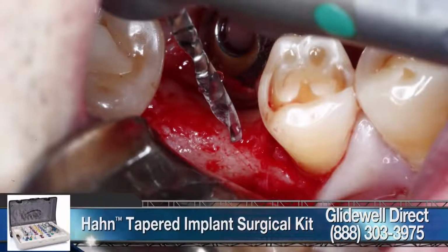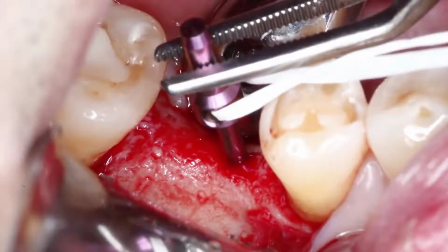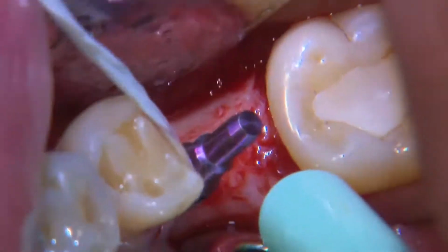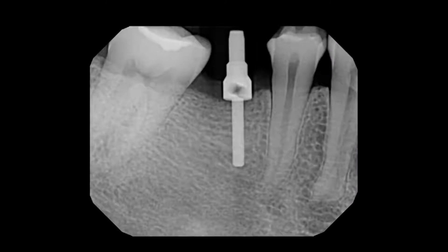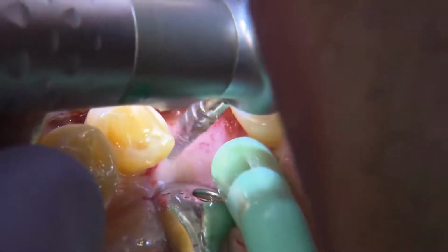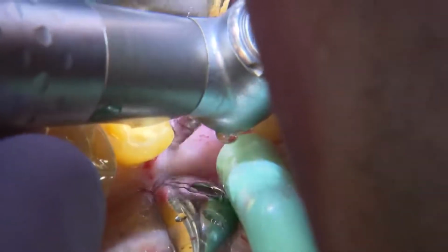my start drill. Usually what I like to do is create that initial osteotomy with the start drill, and then take the parallel pin and place it into the osteotomy site and take a radiograph. This will help me gauge the direction of this implant and whether I'm going in the right direction or not. Visually, I can look at it and say, this parallel pin is coming out exactly where I want my screw access hole if I'm placing a screw retained final restoration. If it's not, then I can make adjustments with every subsequent drill that I'm going to be using moving forward.